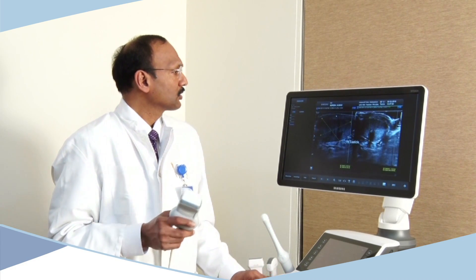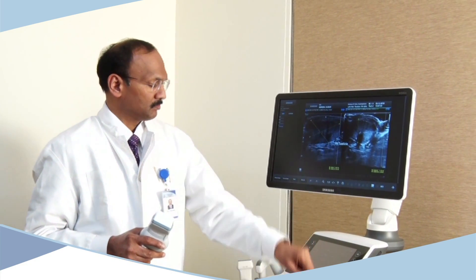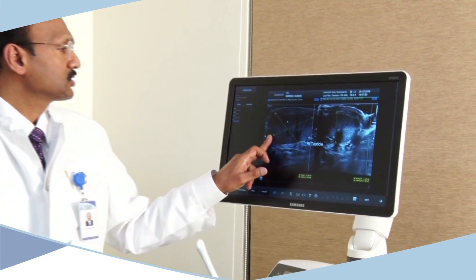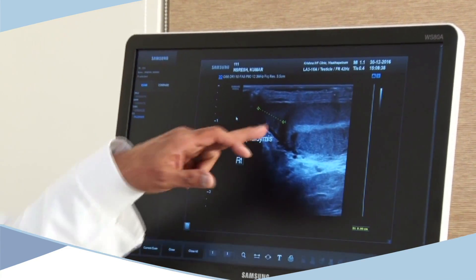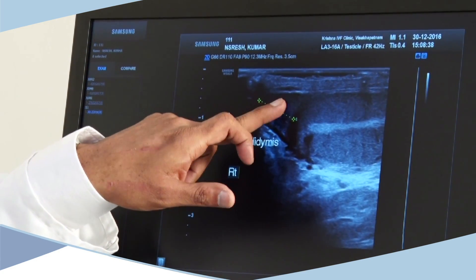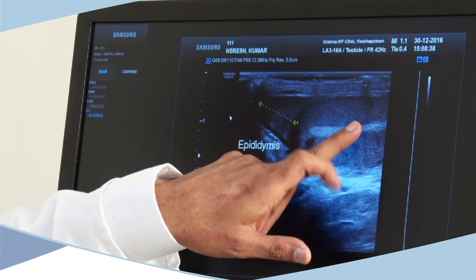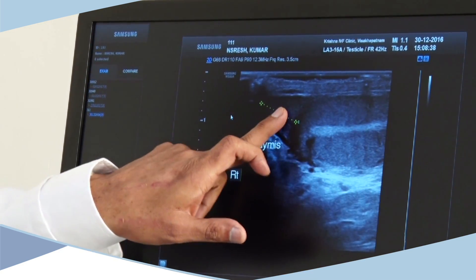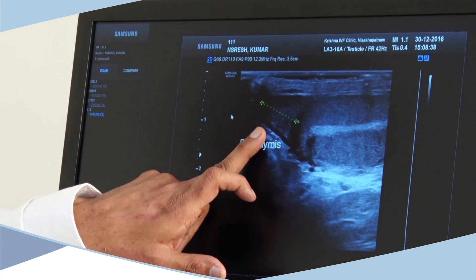For example, when you look at the testis, you can see the skin thickness, the internal tissue, and different planes. You can also see the epididymis very clearly and identify cysts in the epididymis. So using scrotal ultrasound, we can identify problems in both the testis and the epididymis, giving us good quality information.